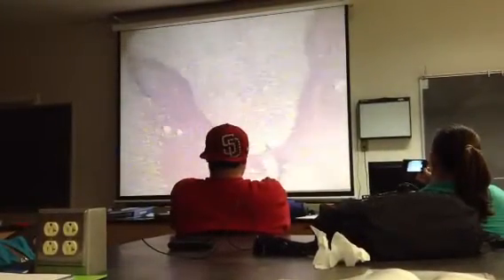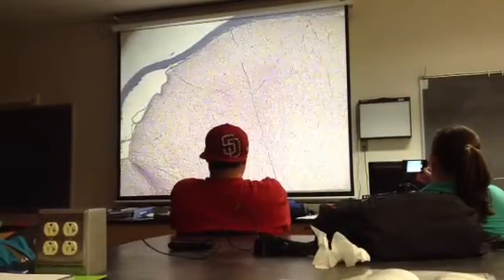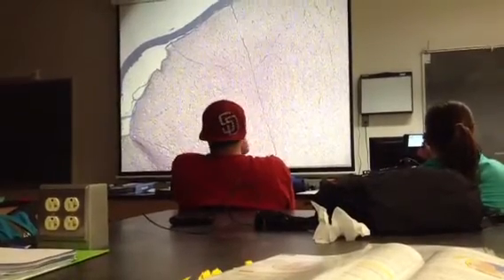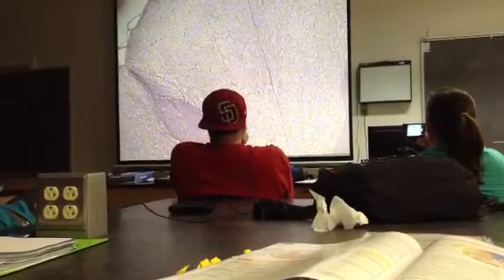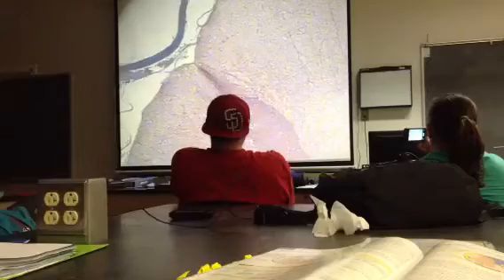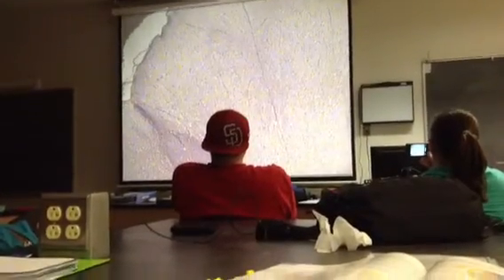We did that, and now we need to do the white matter, which is comprised of those tracts. Tracts are grouped into columns. So this big column back here, we're on the posterior side. What's all this? Posterior white column. Good. Is that an ascending tract or a descending tract?